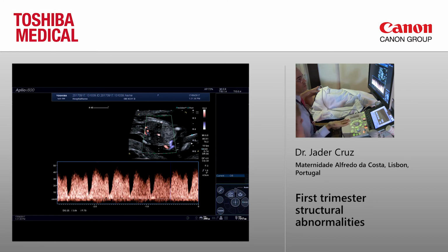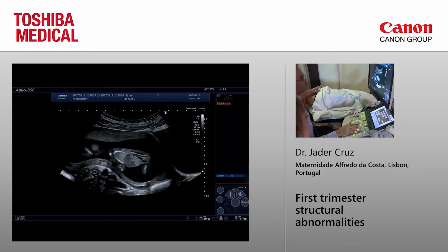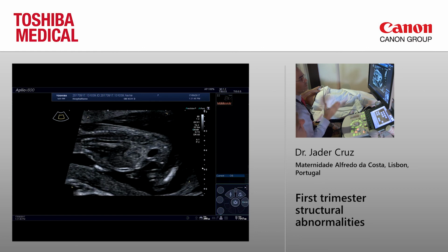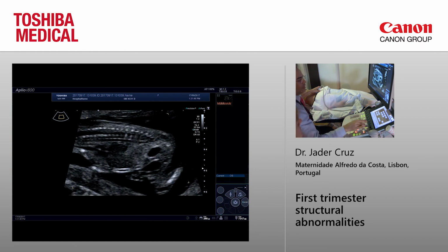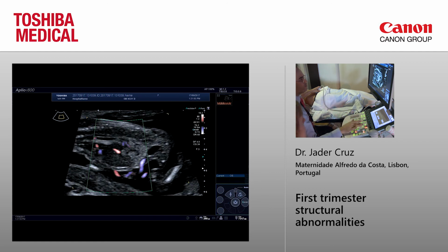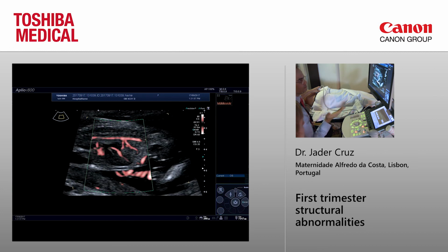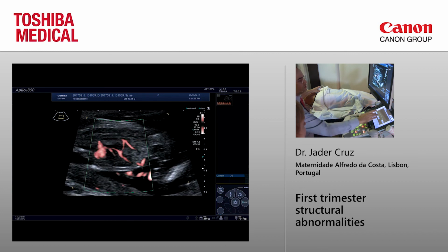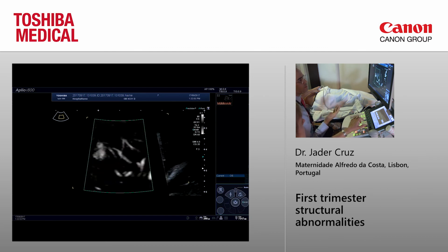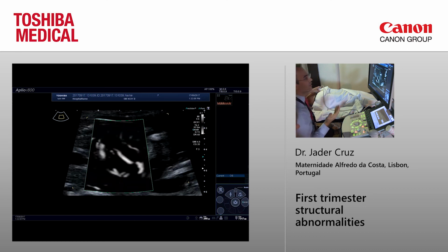You can do ductus venosus in either position, with the baby facing up or the baby facing down. You should have a proper sagittal view of the baby, good magnification, and then place the color. I'm using here the ADF, high definition color. You can use SMI, color SMI, or if you like, you can use this nice color, this nice SMI. You see.